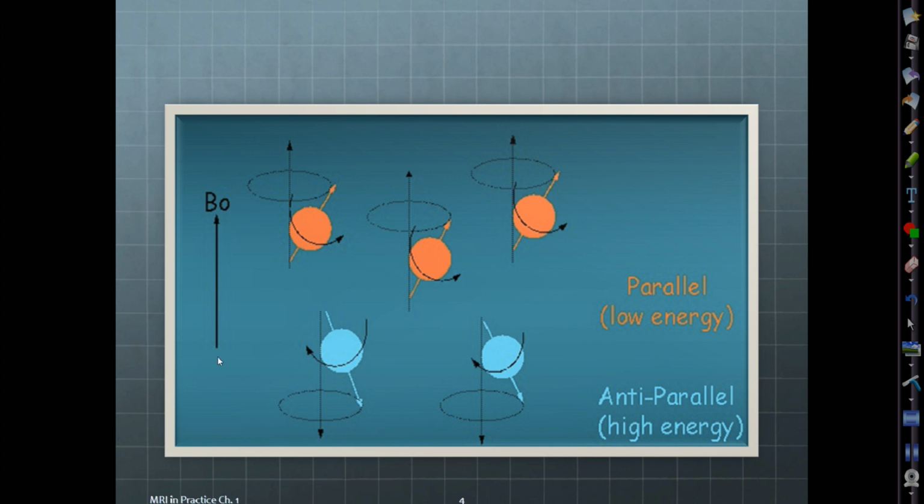But then when you're talking about another external magnetic field, there's going to be another type of spin that gets factored in. We're going to talk about it today, but it's called precession. Okay, it's called our secondary spin. So you have net spin, but then the hydrogen proton also spins around B sub 0 at a certain frequency and along a certain precessional path. So just put it right here next to this little arrow, net spin, angular momentum, and then around this circle right here, put precession. Okay?